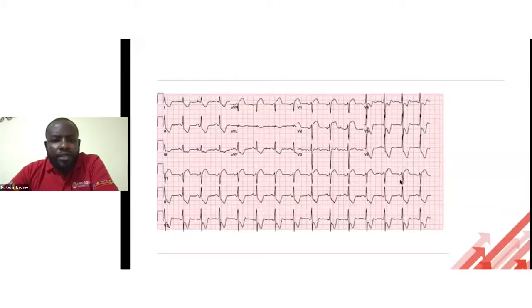When you try and take his blood pressure, it may be low, it may be high, it may be normal, but significantly tearing chest pains, radiating to the back, pain out of proportion. Okay, and when you're doing an ECG, you get this widespread, sometimes widespread ST elevations, widespread ST depression. Okay, most of us have got it. This is an aortic dissection.